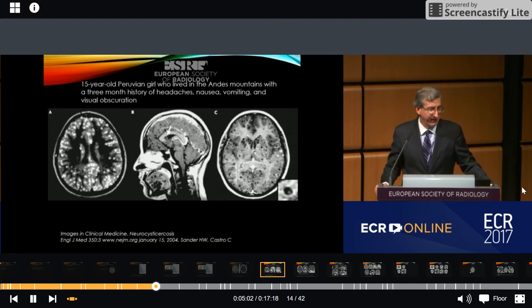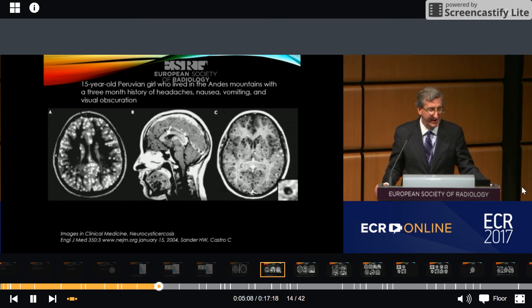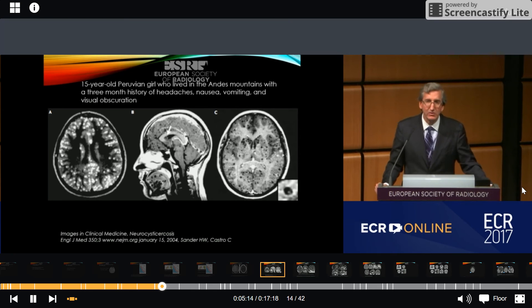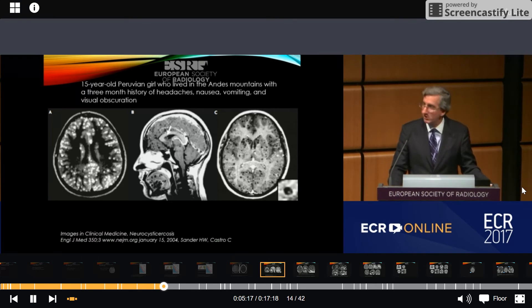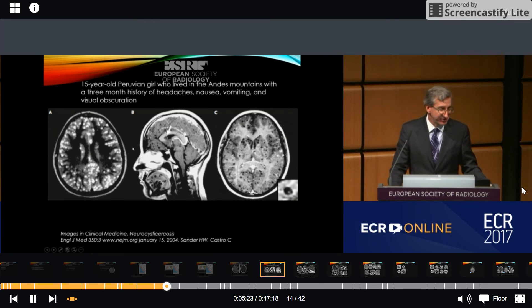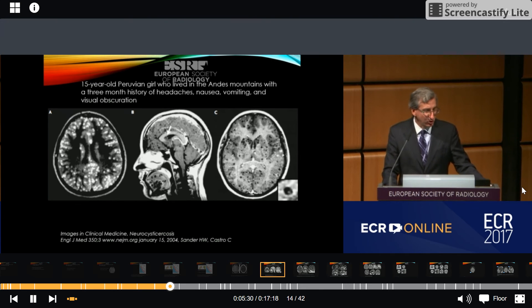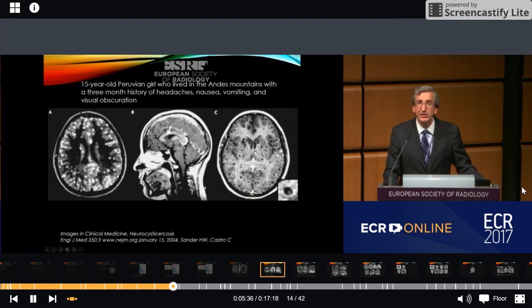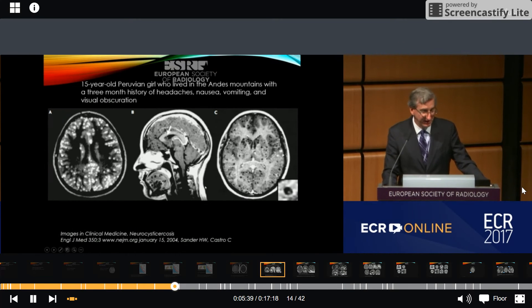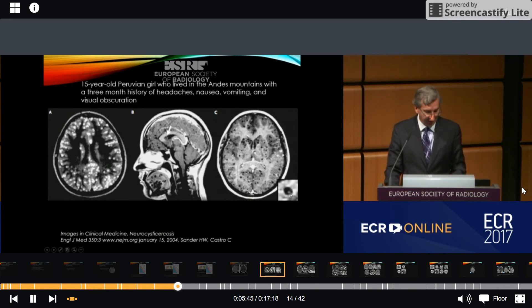I would like to show you this case of a 15-year-old Peruvian girl who lived in the Andes mountains with a three-month history of headache, nausea, vomiting, and visual obscuration. She also presented with visual and auditory hallucinations. We can see here multiple cystic lesions diffusely distributed in the brain, creating a Swiss cheese appearance. We can also see cystic lesions intraventricularly and in the tongue. After the administration of contrast, we can see enhancement on one of these lesions, and of course, we can see the scolex within the cyst.